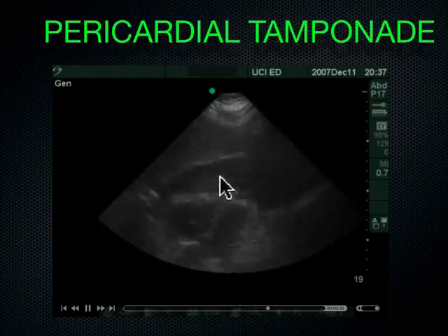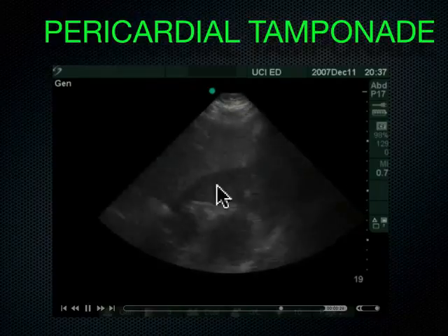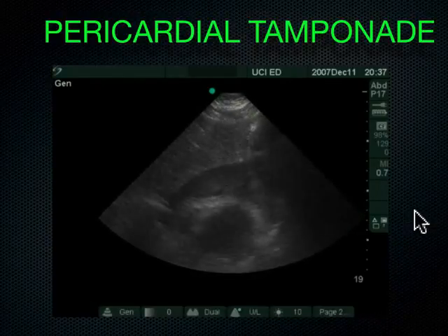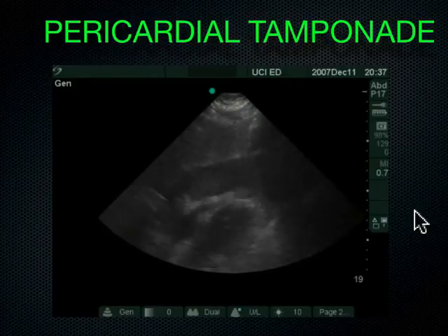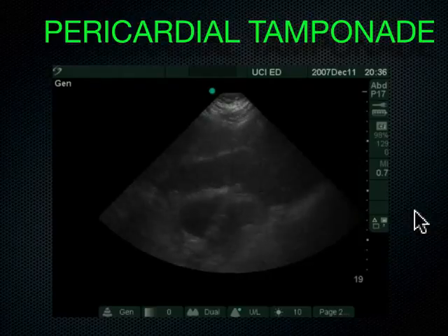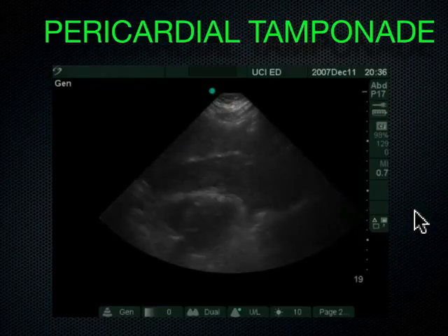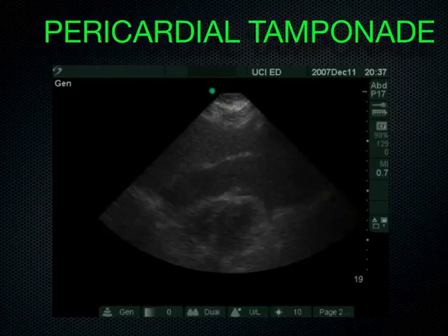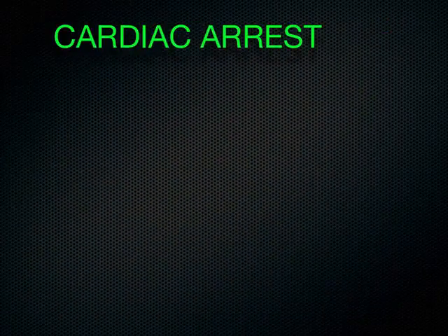Is that clot in there? It's starting to look like it, isn't it? This is sort of isoechoic with the liver. Is it artifact versus clot? Hard to tell. This is off the Sonosite Micromax machine. It's about 4 years old technology now. I would definitely step it up to the Sonosite Turbo technology that we have also in the ED and take a look with that better machine that uses the P21 probe, and that's what I would really be curious of in that case, of a clot actually in the pericardium.